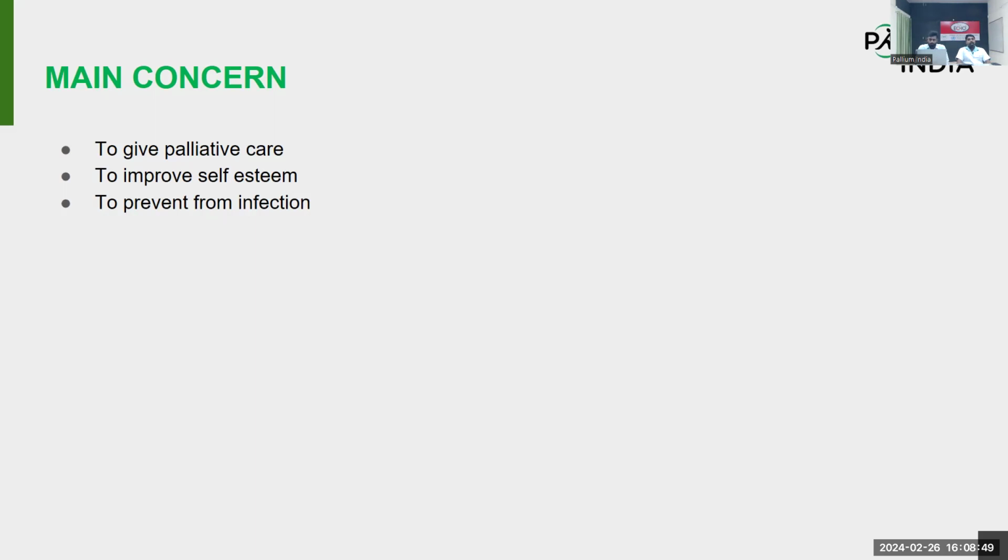One is the peristomal excoriation. If the patient has poor skin care, it will cause skin excoriation and will affect the quality of life of the patient with the stoma. So proper skin care and proper usage of a bag with accurate size can prevent contact on the peristomal region with the leakage from the stoma. Because of that, we can prevent the skin excoriation.